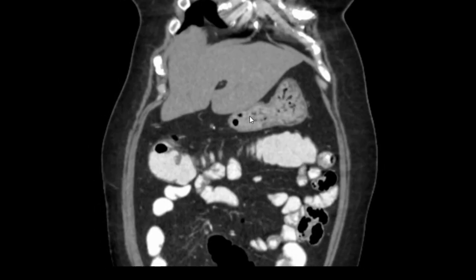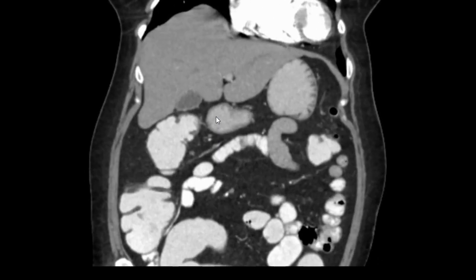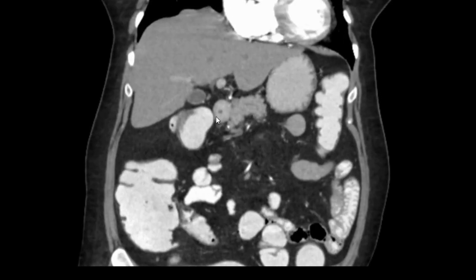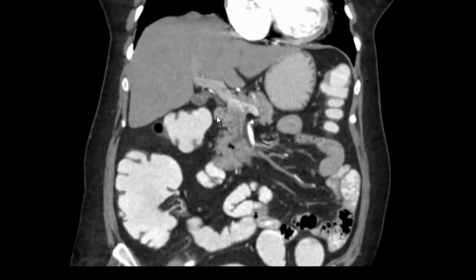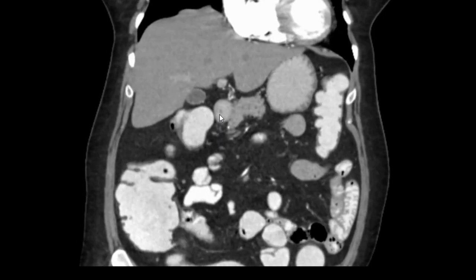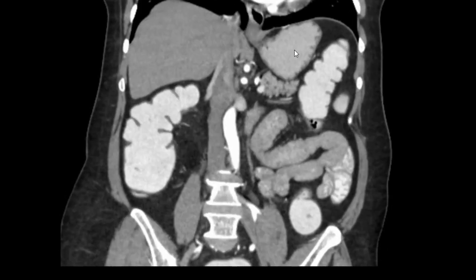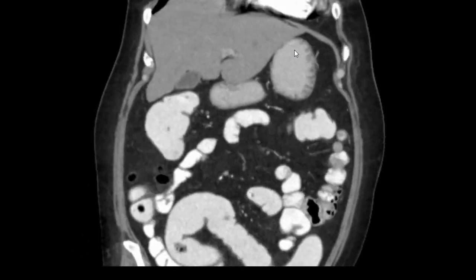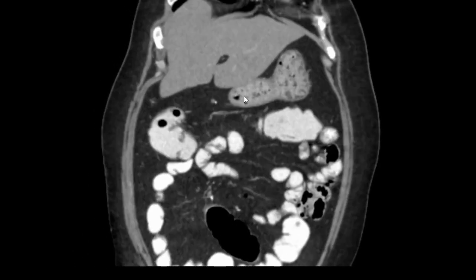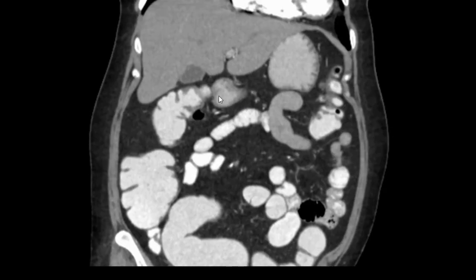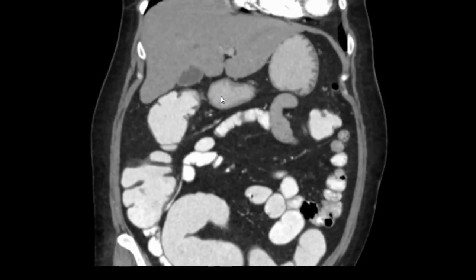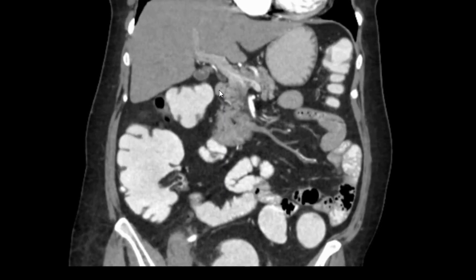The esophagus has joined this structure — keep following it. This is all stomach, and now it becomes the duodenum — the narrowed part beyond the pylorus. This is the duodenum and stomach. Keep moving the console on both sides; keep going down and this is the duodenum. You can see the gallbladder, the cystic duct, and the common bile duct alongside the duodenum.